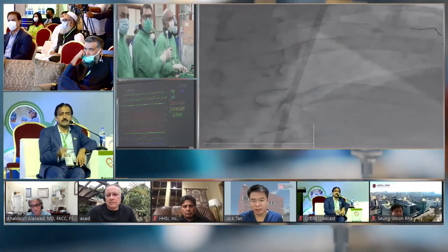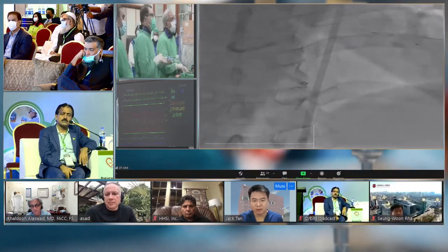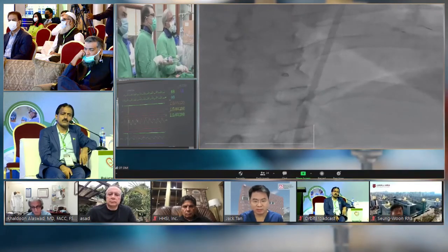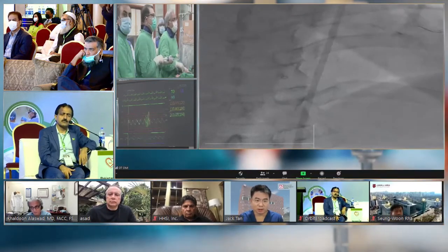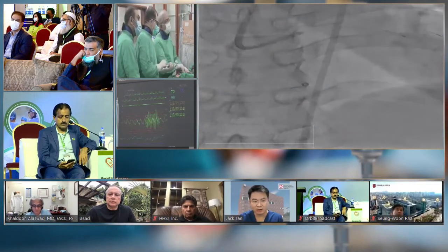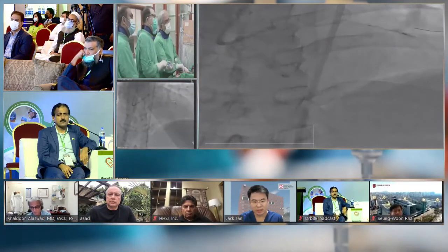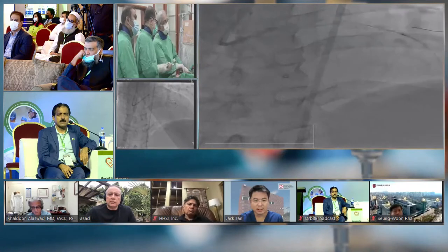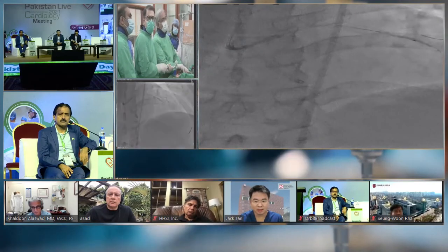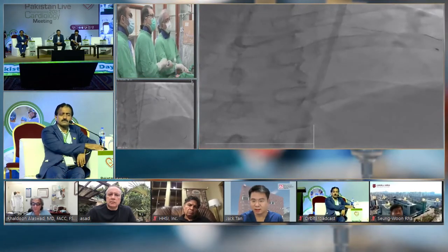The Asian approach generally doesn't like a re-entry approach, but this case is a wonderful case for just an integrated approach. I think all the comments are great. Microcatheter lead into the stump. You may want to test with a workhorse, maybe a bit more hydrophilic wire, like the XT-A or XT-R, and if it doesn't go through, just go straight with a Gaia 2, which should cross in that case, and at best escalate to parallel wire. But less need for either retrograde or re-entry techniques, I think, in this case.